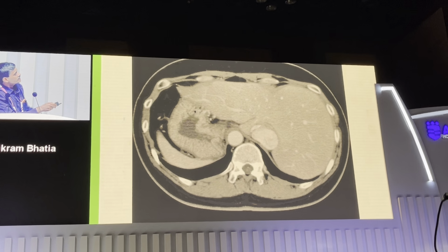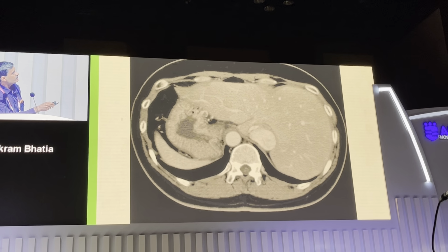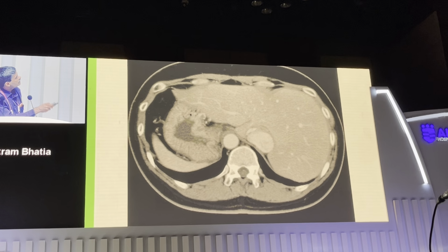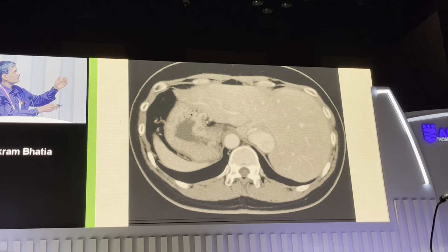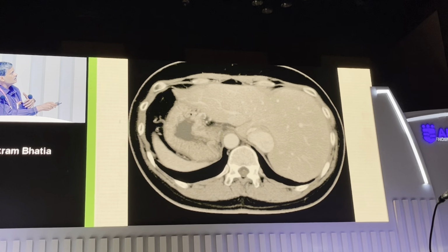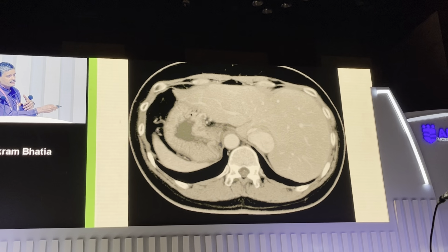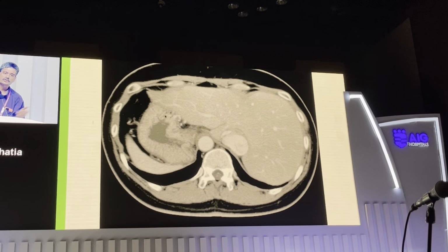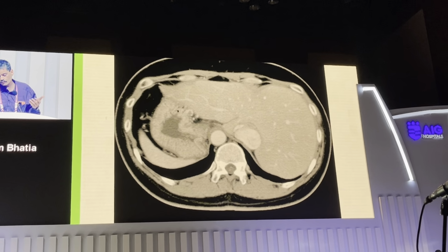So my probe is here as I cross the GE junction. With the knobs neutral, you start to see the left side of the left liver lobe, and as you rotate to the right, you rotate over the caudate and the cava, the aorta, and then the left-sided structures in a sweeping view till the spleen. So that's the logic of how you see what you see.